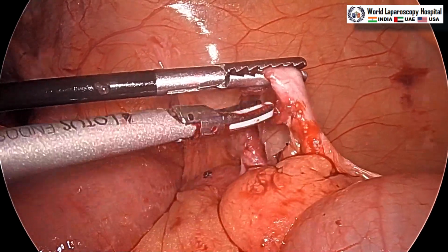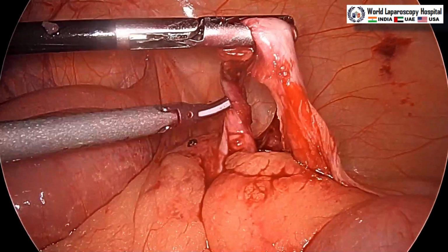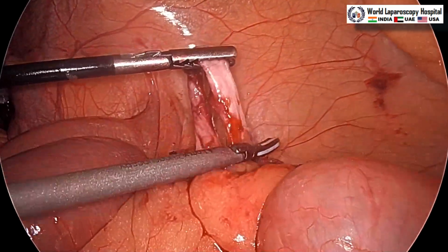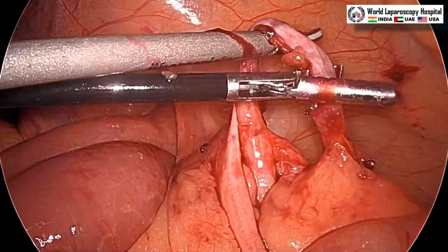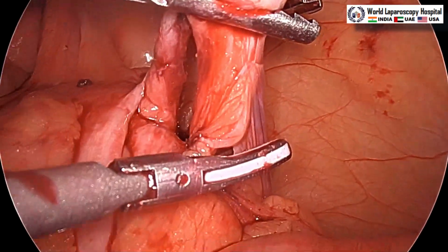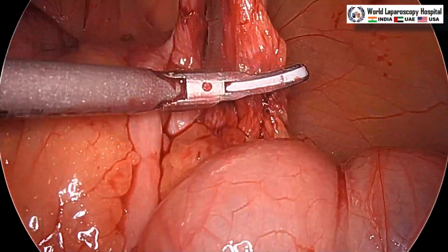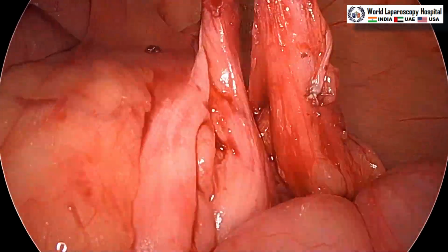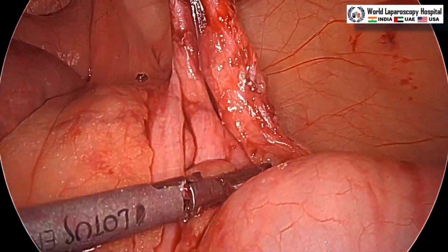Our manipulation angle is very less here. We can see the manipulation angle of both the instruments is hardly 10 degrees, almost parallel, because these ports were for hysterectomy, not for appendectomy. So, that is why it is a little bit of a struggle, because if you want better ergonomics, then you can make one port in the right hypochondrium or suprapubic, then it will be much better. But because both our ports are ipsilateral, the manipulation angle here is wrong. But we do not want to give an extra port to the patient. With a little struggling, we are planning to perform it with the same port.